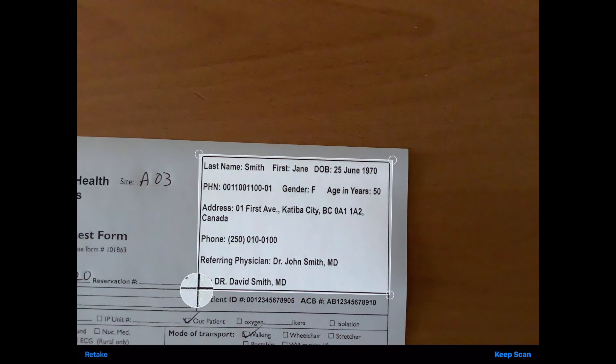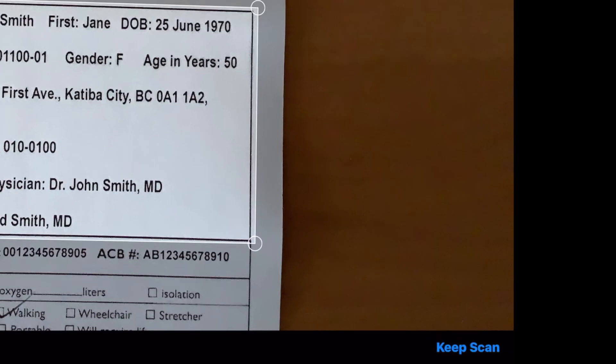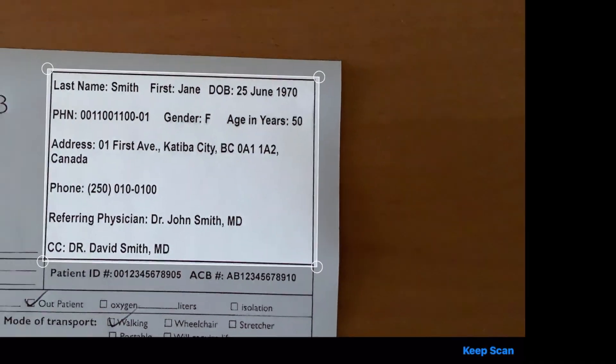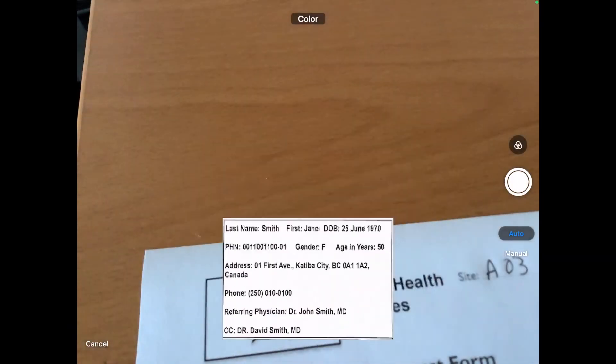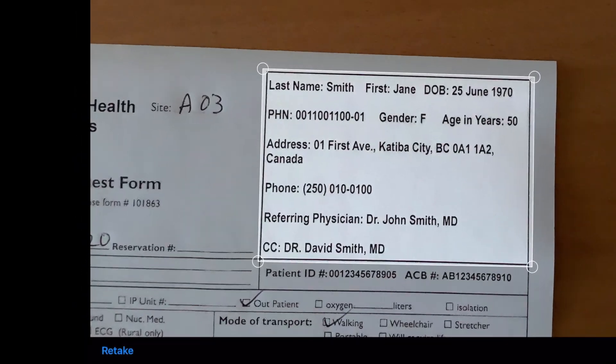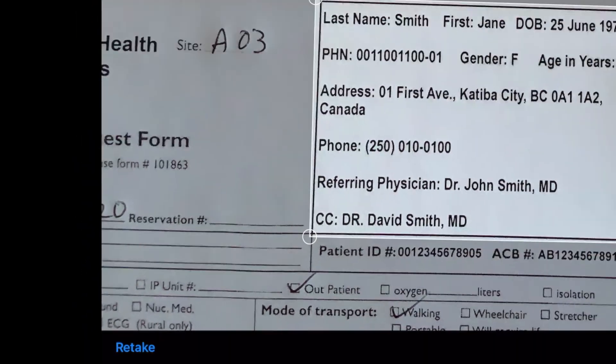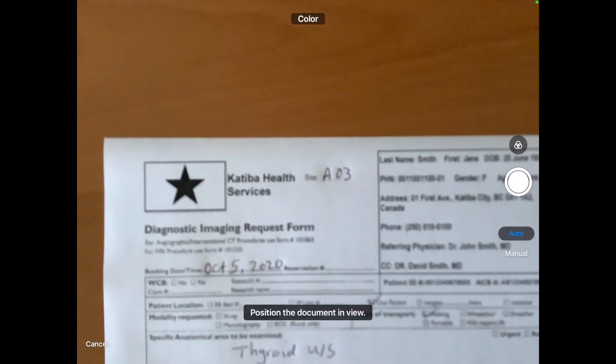If you are happy with the outcome, tap Keep Scan and then tap Save. Otherwise, tap Retake and repeat the process.